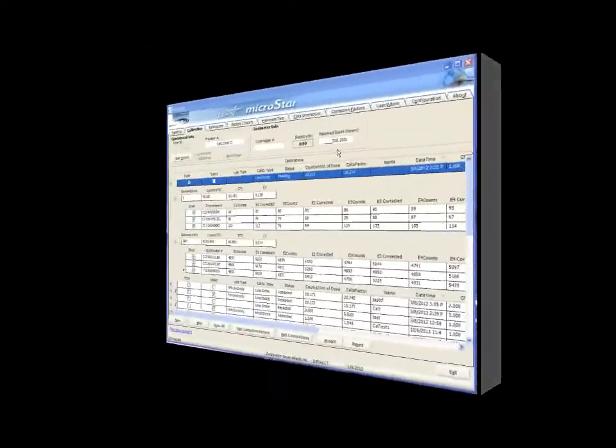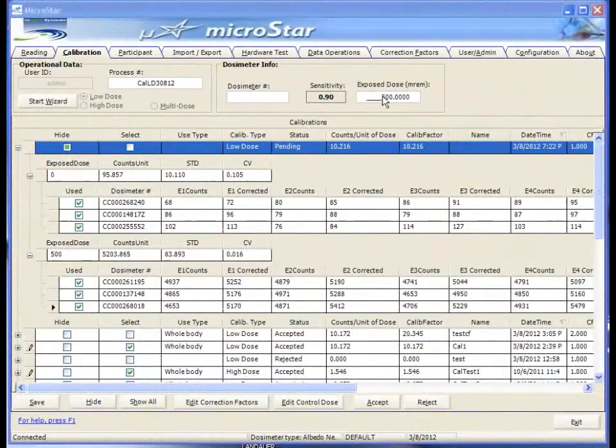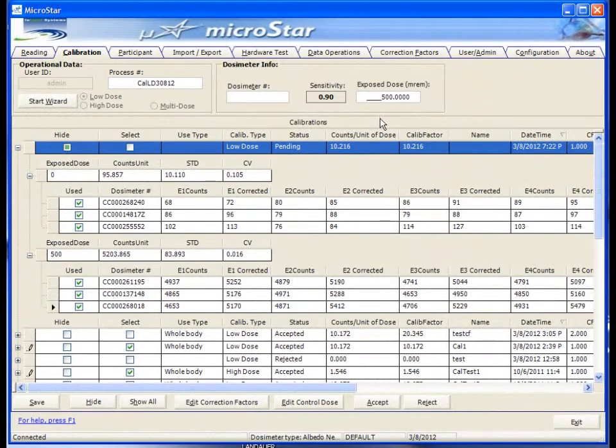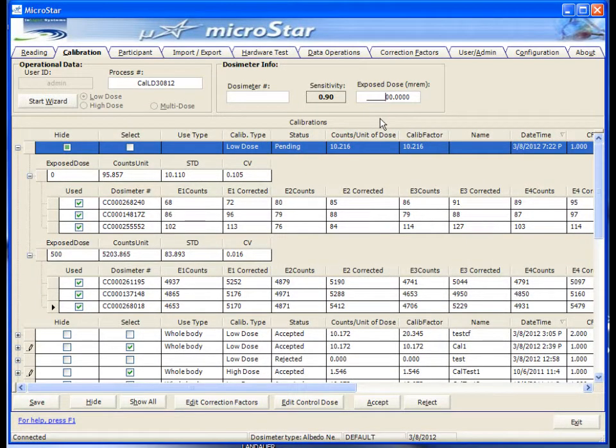Remember when entering exposed dose values, they must be entered in millirem units, or in millisieverts if SI units are selected.